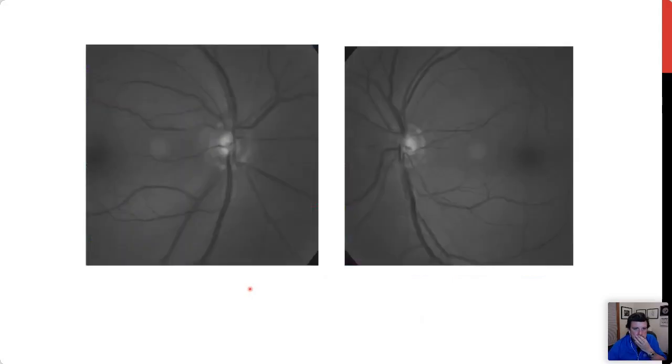And Greg, if you go ahead. And when I saw the patient, fortunately, I took photos. And as I look in the left optic nerve and nerve fiber layer, that left superior temporal area, the nerve is absolutely fine. There's no focal defects of the neuroretinal rim or nerve fiber layer. But if you go inferior temporal on the right eye, what you see is a large wedge defect that corresponded to that very, very small defect on the OCT. And what showed up as abnormal in the OCT is physiologically normal on this patient. So this is a classic example of a person who had red disease in his left eye and actually green disease in his right eye.